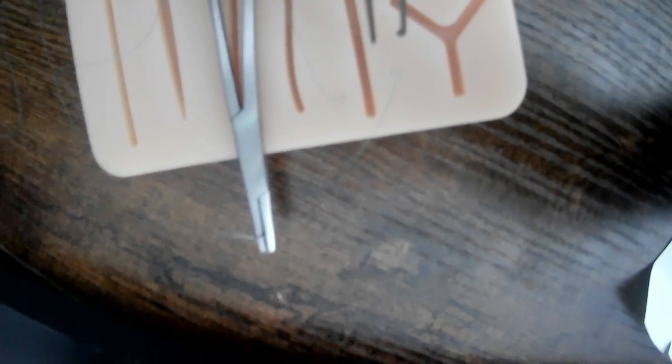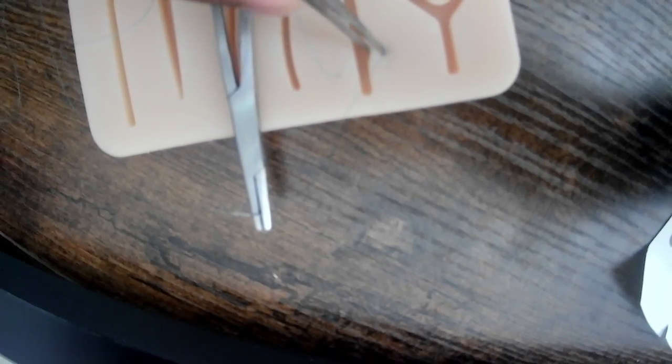But it's kind of weirdly angled. It's diagonal. It's not perpendicular to the wound, if that makes sense. If you can see the... this camera sucks again. Yeah, the suture is kind of underneath, if you can see. Let me... can you see the skin?